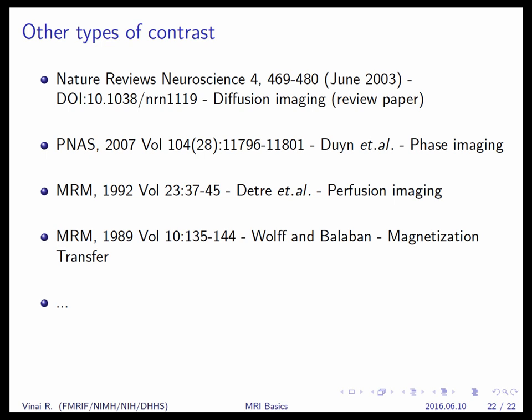So in a given voxel, that represents the amplitude of a particular frequency that we detected back from the subject. Yes. Well, if I could add, the signal from a voxel is really complicated. It's a combination of the relative proton density, how much tissue you have in each voxel that might have a different T1 or T2 relaxation rate, and then a function of what your echo time or TR is, which determines how much you're weighting the T1 or T2. So it's all those things combined.